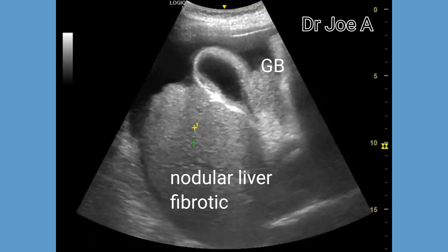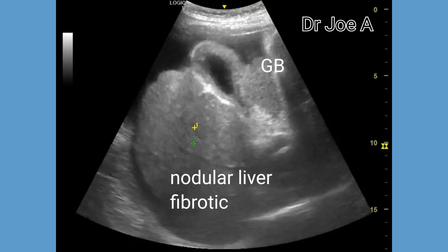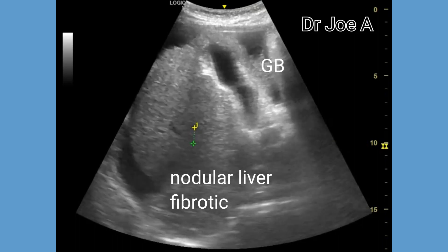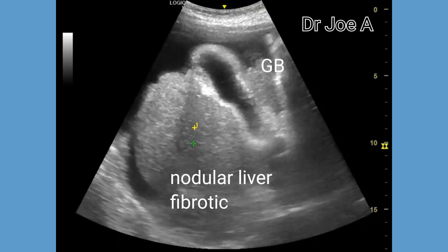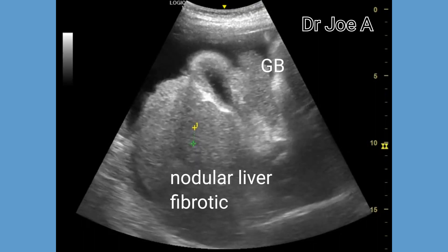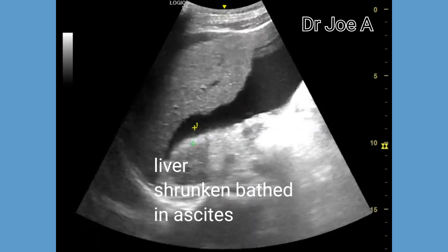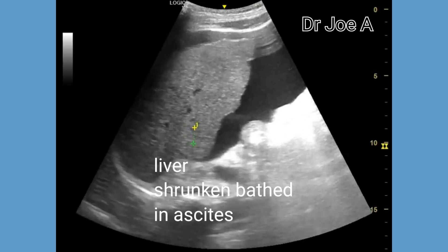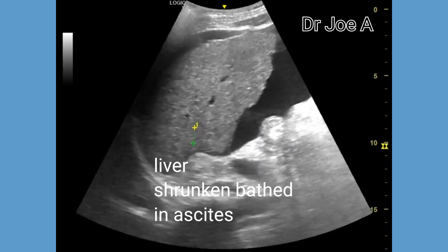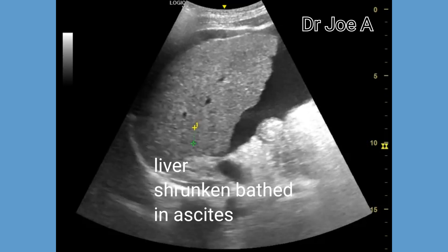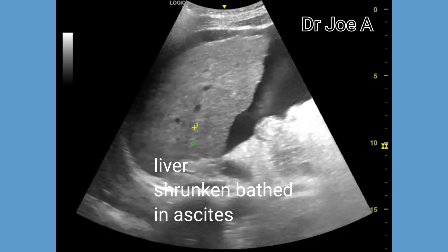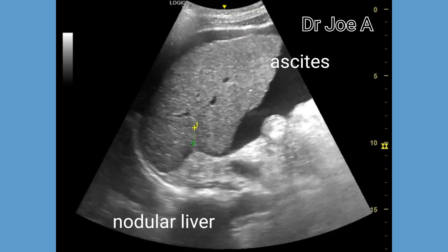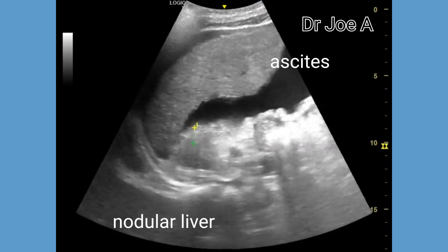The liver and gallbladder are outlined by the ascitic fluid. This appears to be the right lobe with a grossly nodular surface. The liver is almost completely surrounded by ascitic fluid.